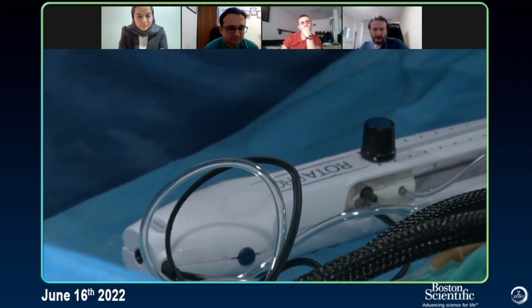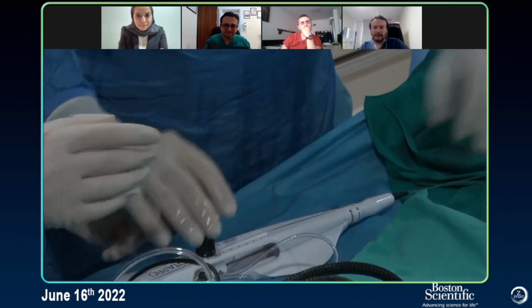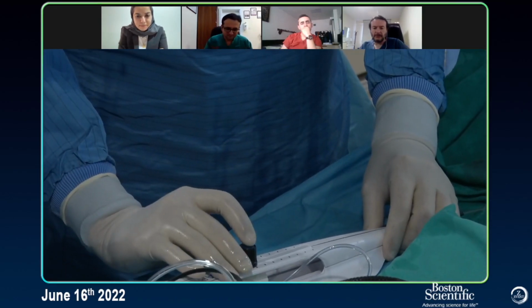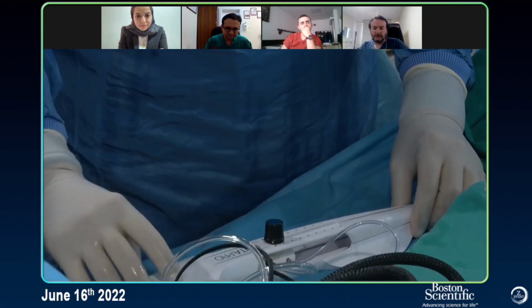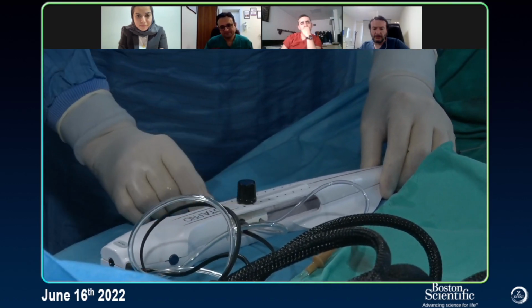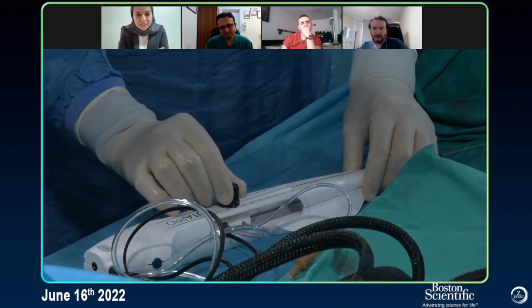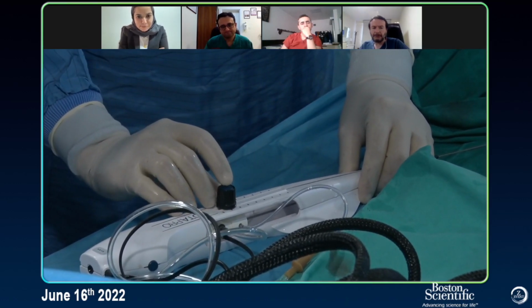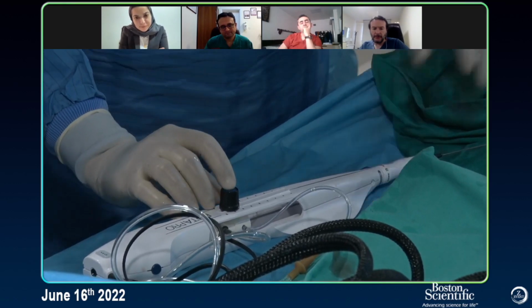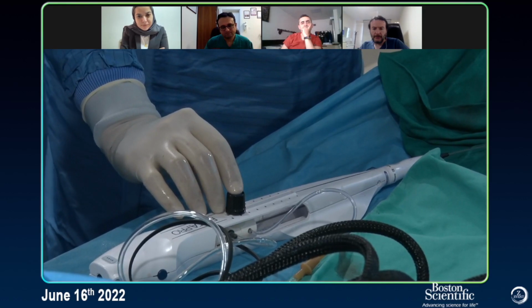All right. Keep it straight. Now, yeah, we have to keep it straight. Do you see that? You're going to do a test run. We push the advancer knob to start rotating the burr, and we will see it. Yes, and we will test it.